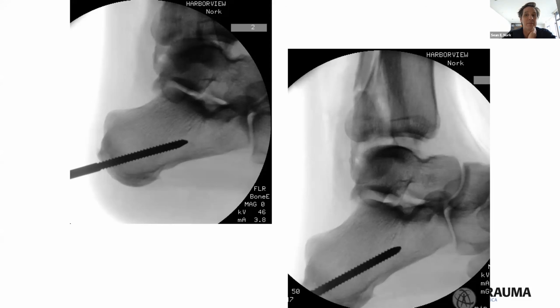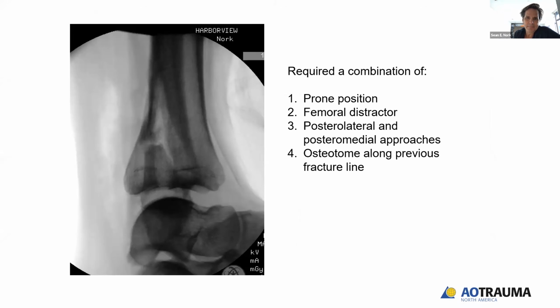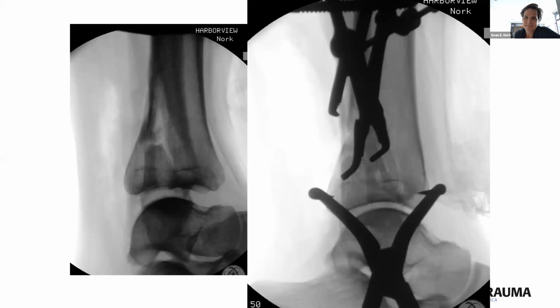I couldn't do it because, like Tim said, it makes me feel ill. So I made Ben Ershka come in the room and do it, and then go back to doing a gastroc slide in room 14, which is what he does all day, in addition to complex problems. And then the problems that everyone identified, just recreating the fracture with an osteotomy, cleaning it, and you can see even with clamp applications, it's still not compressed. So to Mitch's point, clean for hours, and still it's so difficult to get that last bit of compression.